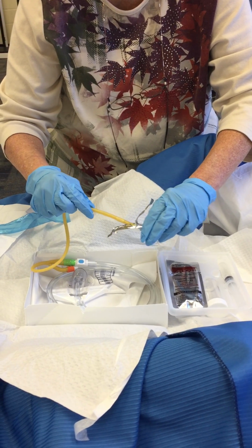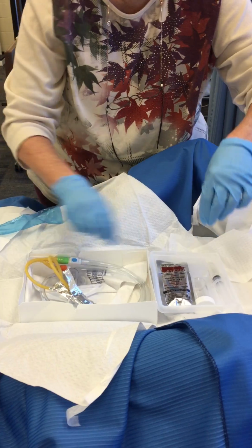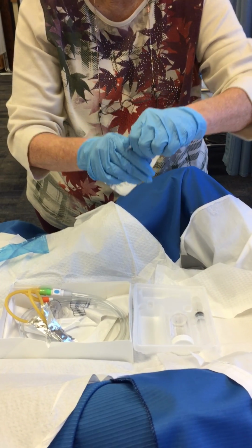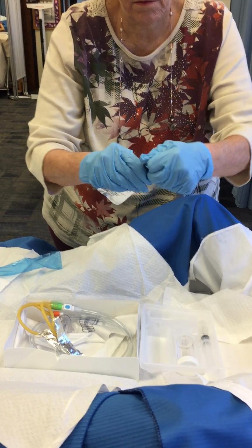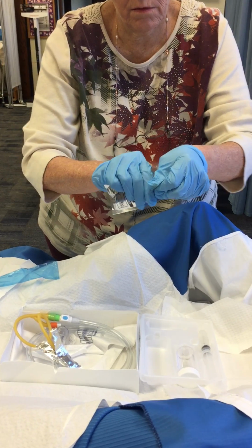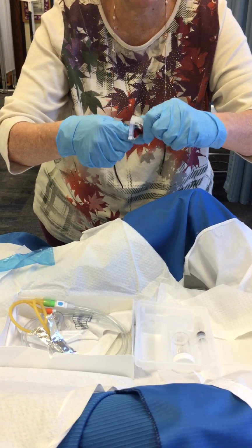Stick your ends of your catheter into your lubricant, because all this is sterile, don't forget. And open these. I've never been more proud of my opening ability than I am right now.